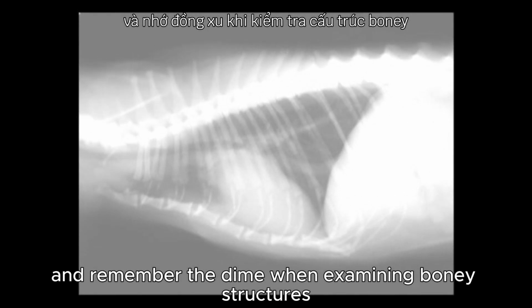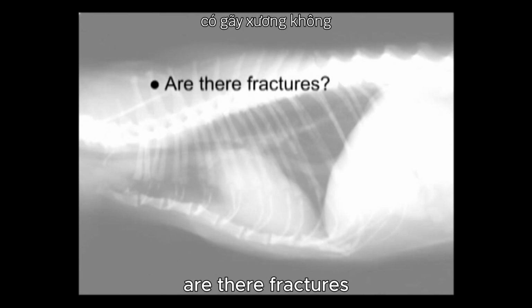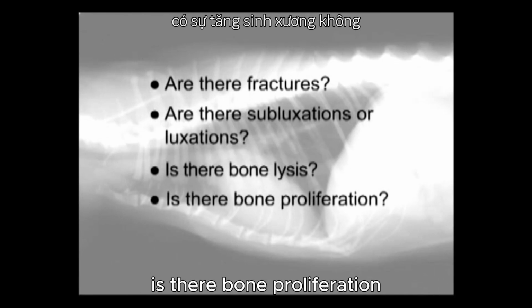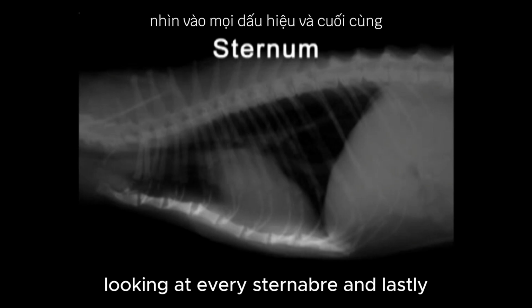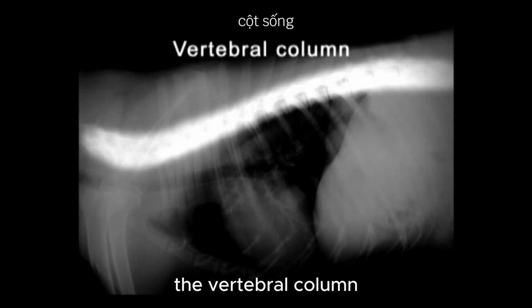When examining bony structures, always ask yourself the following questions. Are there fractures? Are there subluxations or luxations? Is there bone lysis? Is there bone proliferation? After the ribs, shift your questions to the sternum, looking at every sternebra. And lastly, the vertebral column.